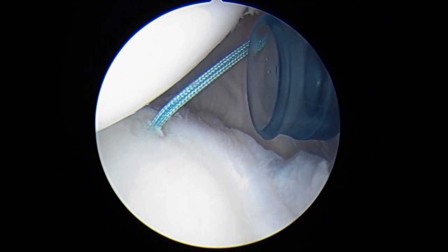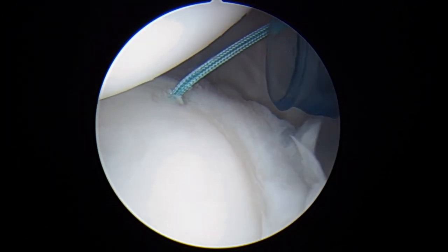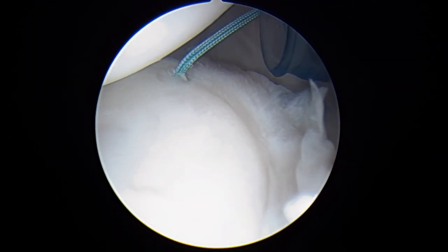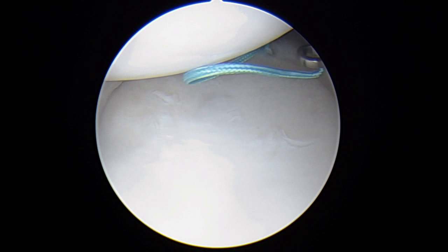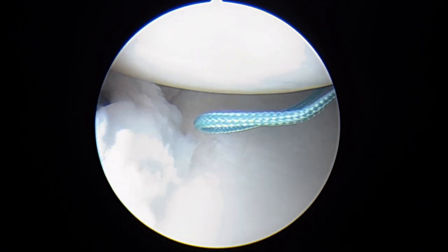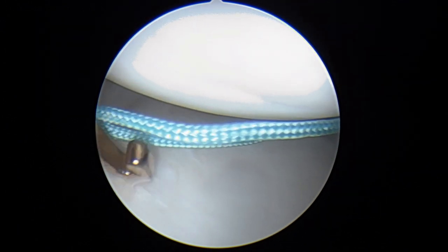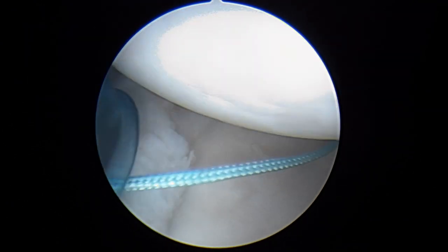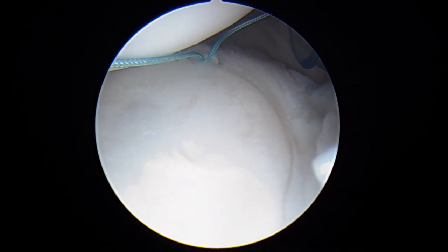We're going to take one suture out of the front using a pincher tool. We'll grab one of the sutures here, and then we're going to come in from the left side of the screen, which is actually the front of your shoulder. We'll retrieve that one suture and check to make sure that our cannula is in good position. And now we're going to take a grasper in the back.